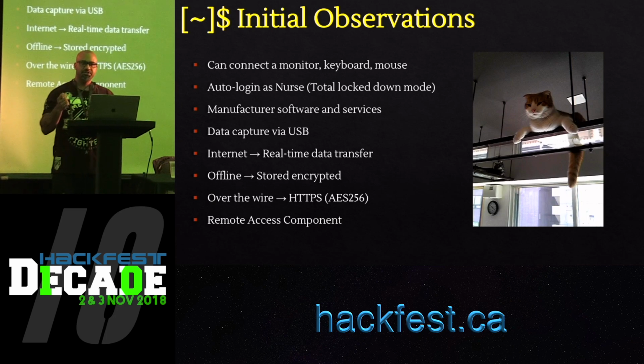While writing the prescription, if the pen is connected to the internet, it will transfer the data to the pharmacy in real time. But if it's not connected to the internet, then it will store that prescription in an encrypted manner on the disk of the pen. And once you dock it and it connects to the internet, then it will transfer the data. The data was transmitted using SSL, so we looked at it, but there wasn't much in there. There was also a remote access component where it had TeamViewer installed, where manufacturers could log in remotely and connect to it to upgrade the device.